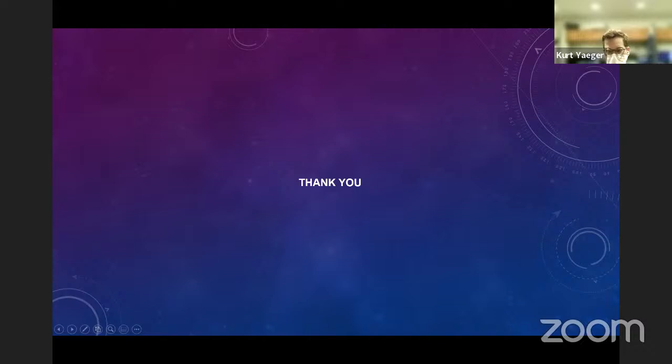Thanks. Just had a comment or a question. Shahram, great job. Thank you for presenting that. And one thing to respond to Dr. Hajipanias is I actually have had the benefit of seeing the MMA after tumor embolization. And I've seen that in some cases of onyx that sometimes there are little channels that blood still kind of seeps through. Maybe for some reason these tumors have a more hypertrophic MMA or something like that, but I definitely see a little bit. So maybe it thromboses over time, like you said, but I've definitely been able to see it from the other side, which I think is kind of interesting.